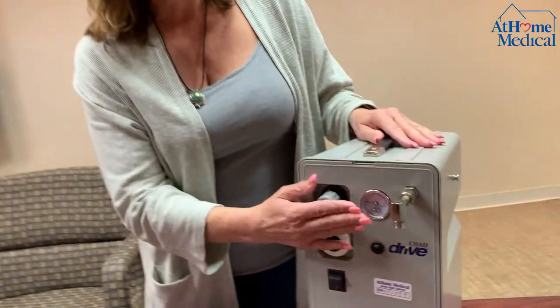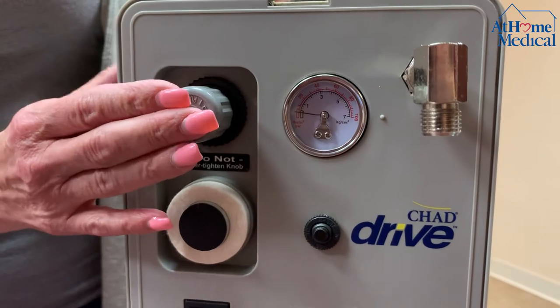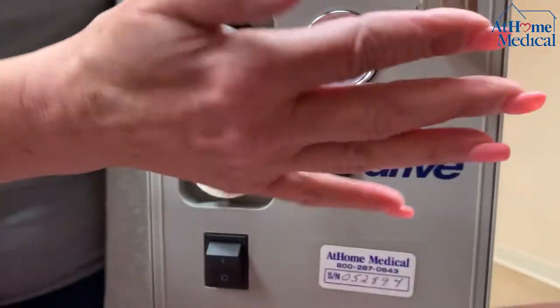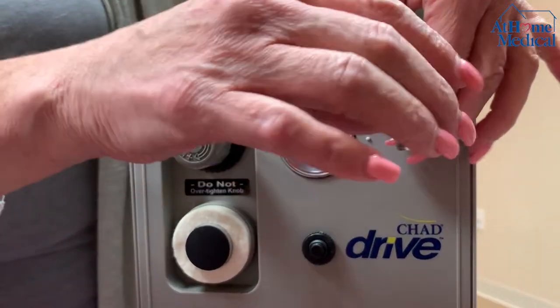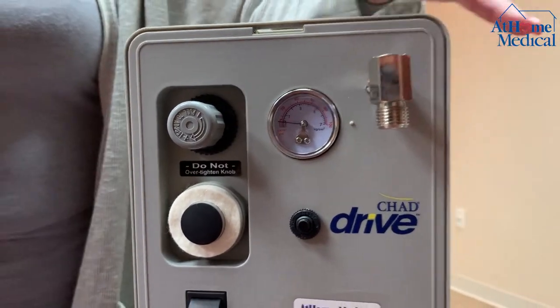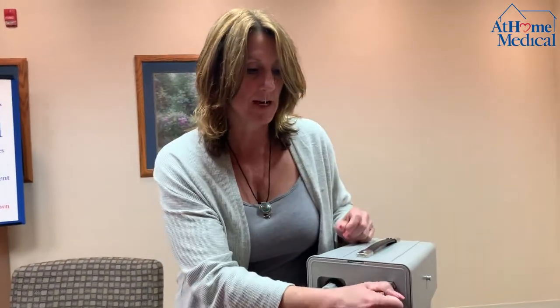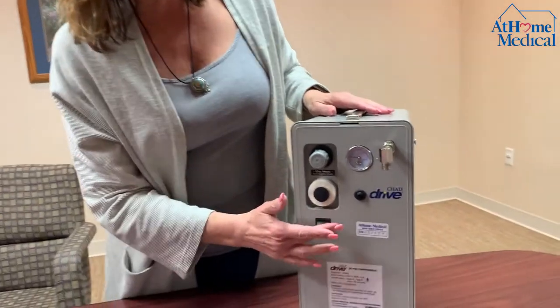On the front of the machine you're going to see a dial, and we would preset it before it leaves the warehouse. There's also a connection on top — if it's not connected for some reason it will be with the machine in the bag; you just tighten it up and connect it to the front. This is your on/off switch.